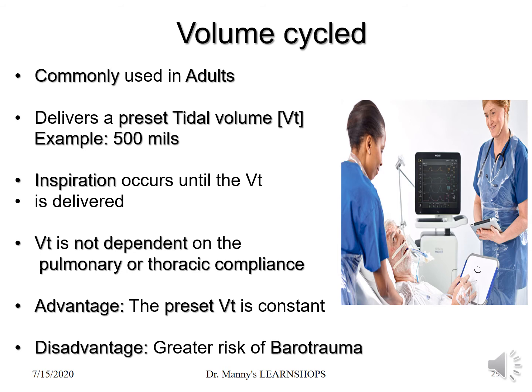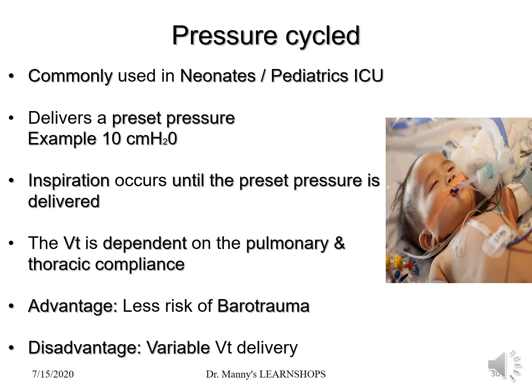The disadvantage is because it's delivered, regardless of the situation or the condition of the airways or lungs, there's a greater risk of barotrauma. Barotrauma being pressure trauma, which could be pneumothorax, pneumopericardium, subcutaneous emphysema, pneumoperitoneum, the list goes on.